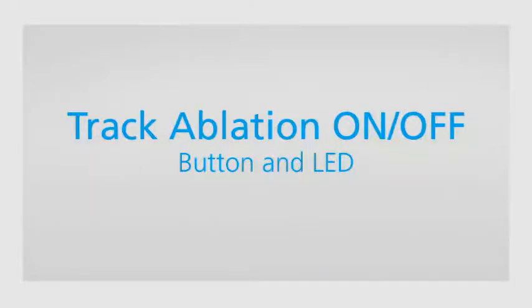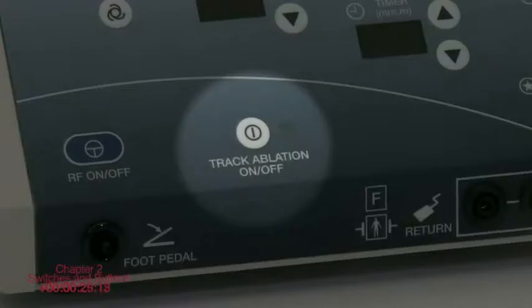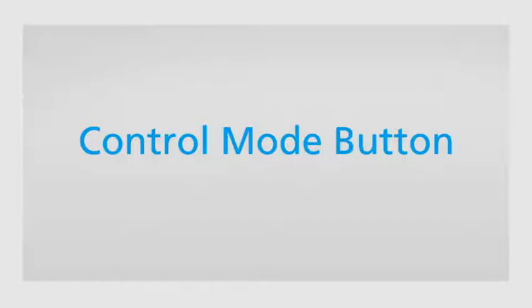Track ablation on-off button. Cauterization, coagulation. Pressing this button switches the system in and out of track ablation mode. Track ablation on-off LED. Cauterization, coagulation. A green LED that is off when this mode is not selected, flashing when the mode is selected, and on continuously when the mode is active.